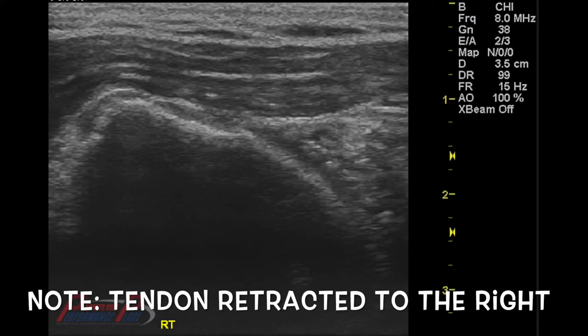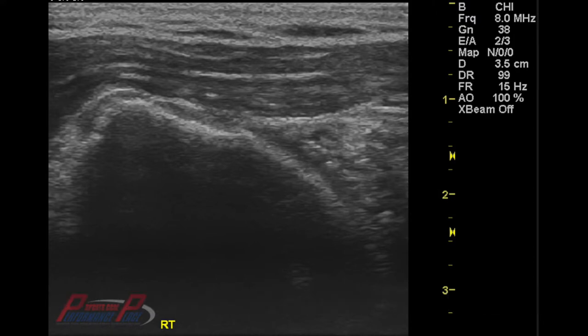You can see this is actually a very large full thickness tear of the distal supraspinatus. The tendon is actually retracted from the greater tuberosity approximately two centimeters medially.